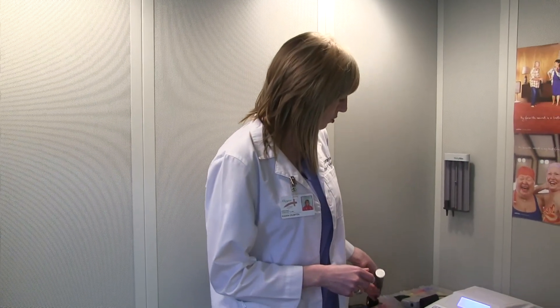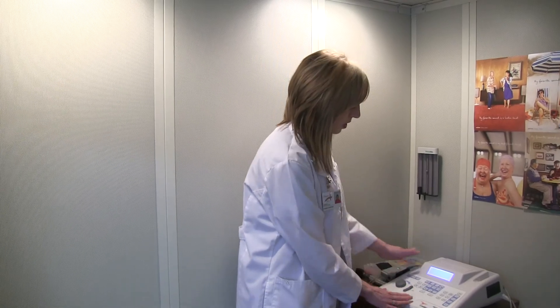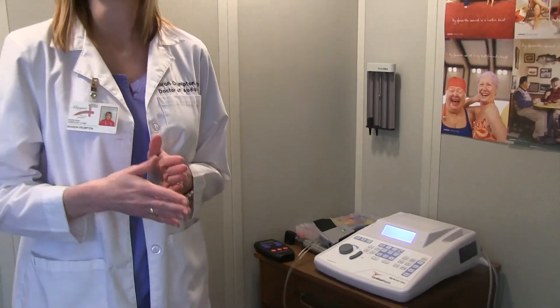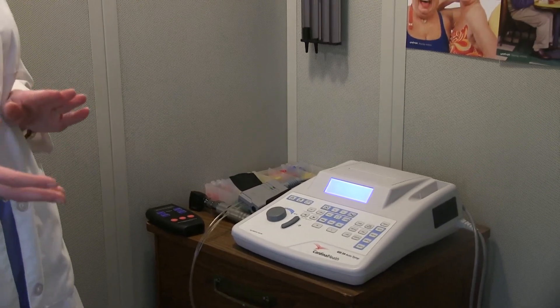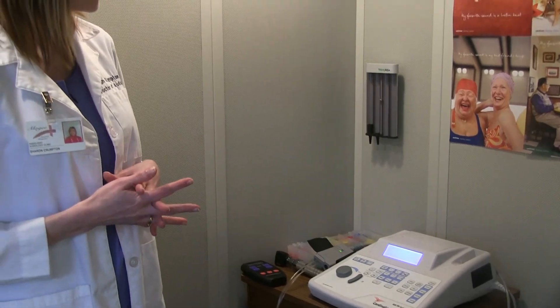Then we will of course test your eardrums using tympanometry, which is this machine right here. This will give us a very accurate representation of how well the sound is getting through the eardrum. It will tell us if there is scar tissue on the eardrum, or any blockage like a middle ear infection or fluid, before I start the hearing test.